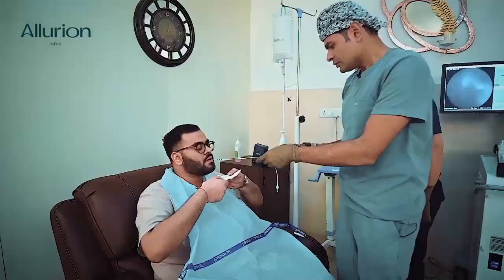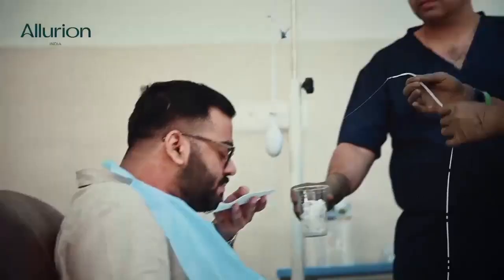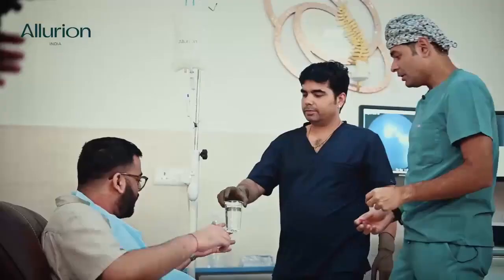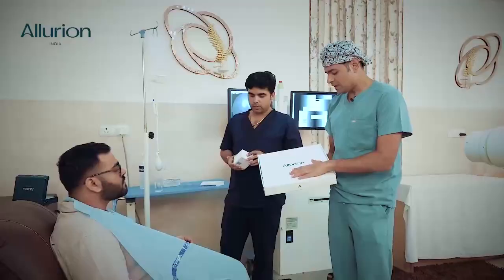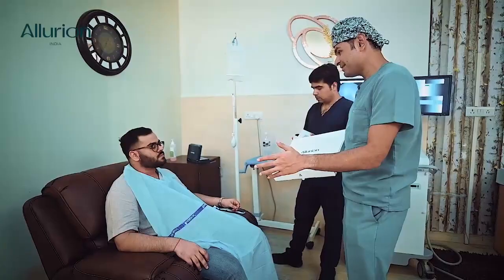I'll remove this now — you might feel a little bit of a tug. Take a little bit of water because you will feel very heavy; just take sips of water. Now once we have done the complete process, this is called the Allurion connected scale. It contains not only your weight but several other metrics.